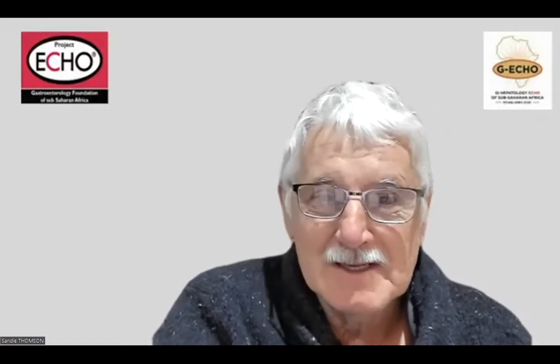Thanks very much. That is a real potpourri through the whole gamut of things that you might or might not see down in endoscopy and what to do with them. There are a few questions in the chat box, and let me just have some of them. They relate backwards, but I think we can pick them up.